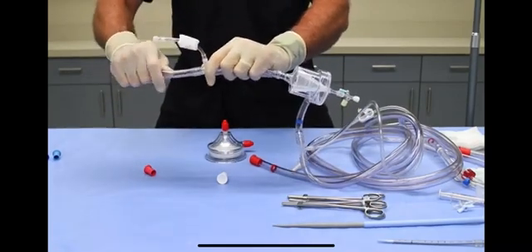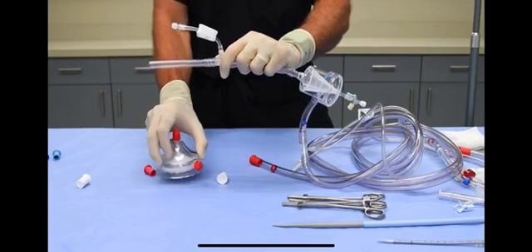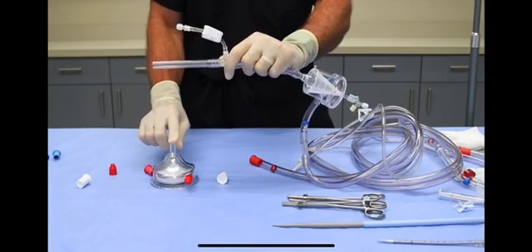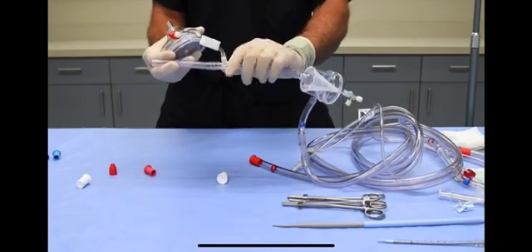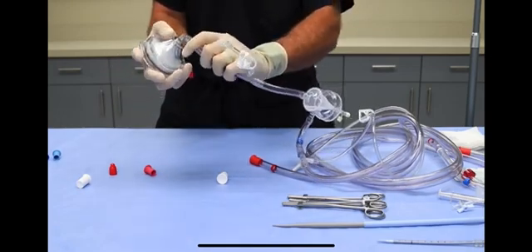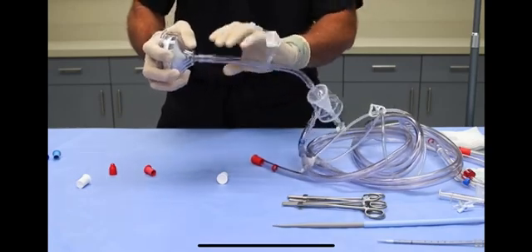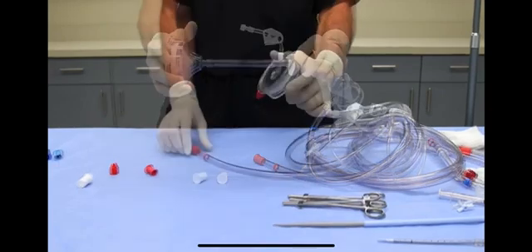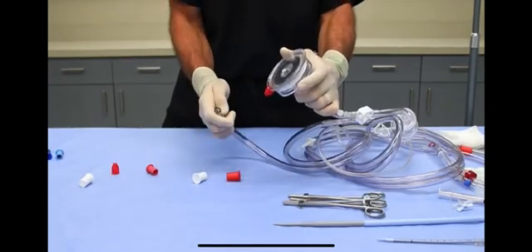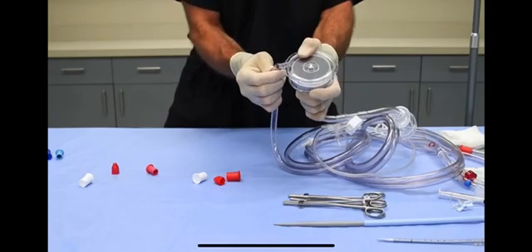Now, remove the remaining white vented cap from the waste line T connection and connect it to the inlet port of the pump head, ensuring the outlet of the pump head is aligned with the inlet of the bubble trap. Finally, remove the red vented cap from the Angio-Vac circuit and connect it to the outlet port of the pump head.